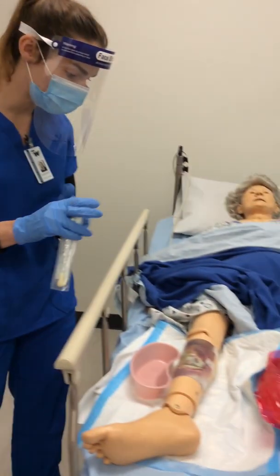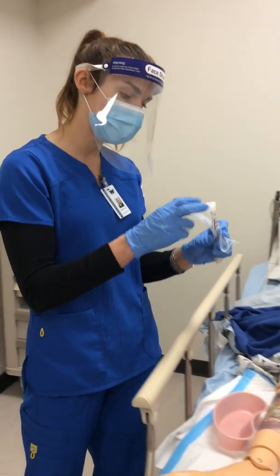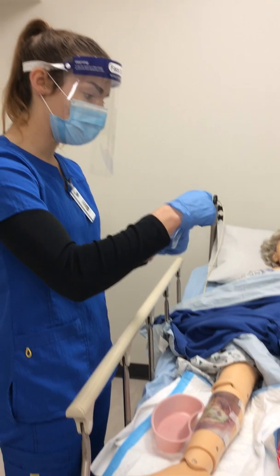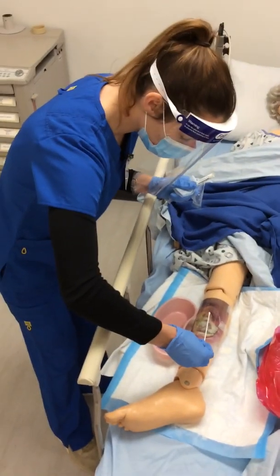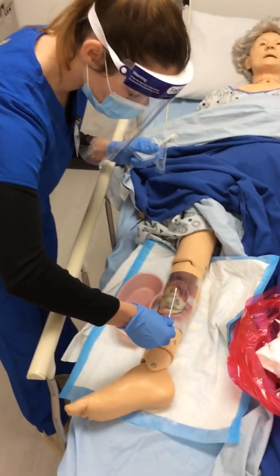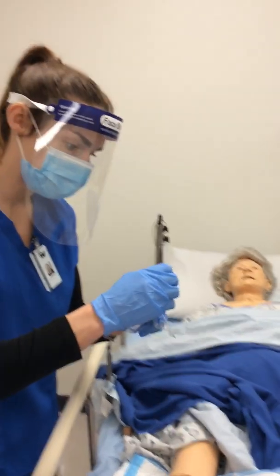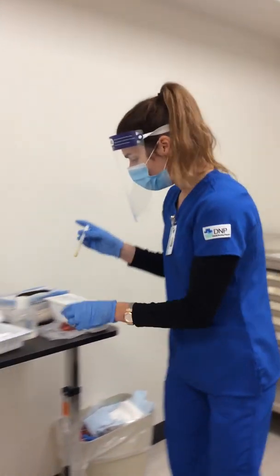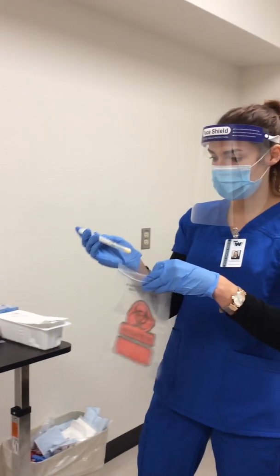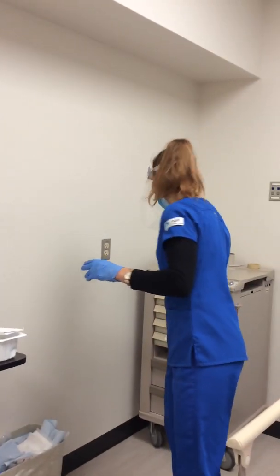Then we will collect our wound culture. So I'm going to get my wound culture, and we're going to collect the specimen from a healthy wound bed. You don't want to go into the sloughing. So we'll carefully get it in this pink wound bed, swirling it around a little bit, and then place it into here. Then we can discard that in the trash. We'll put her name, date of birth, time of collection, date of collection, my initials, and then I'll have my CNA take it down to the lab for me.